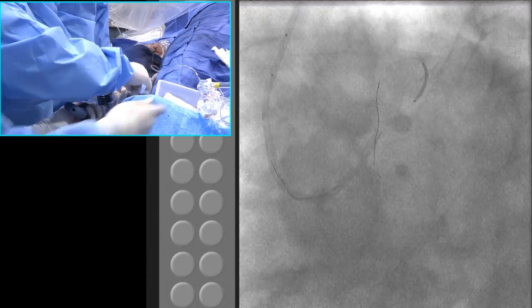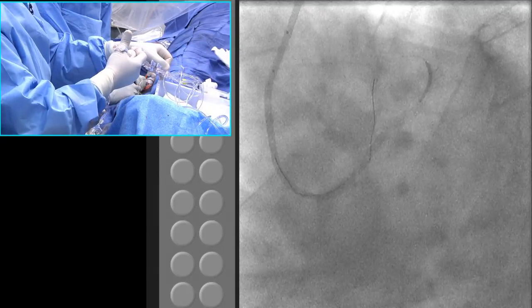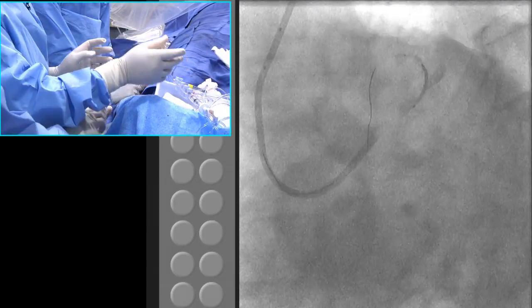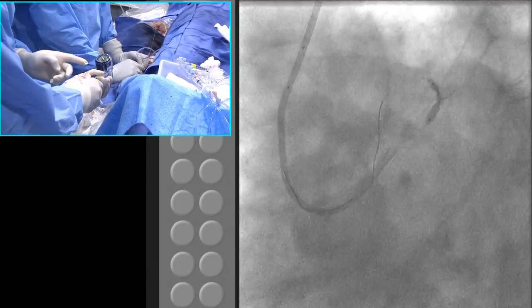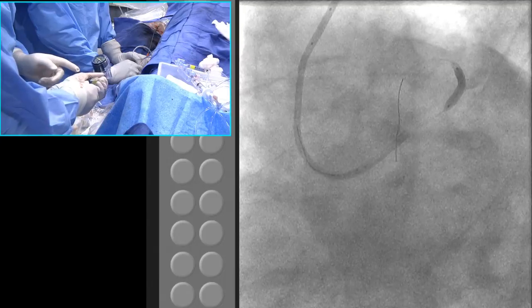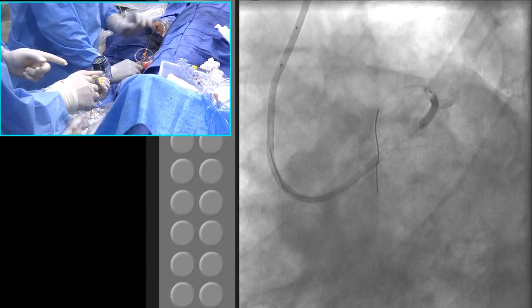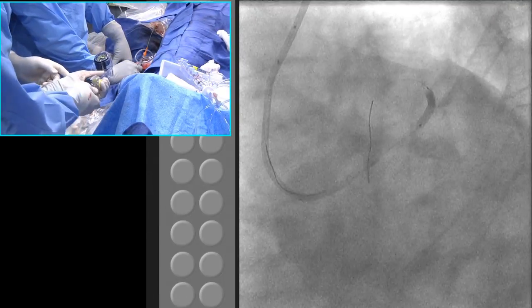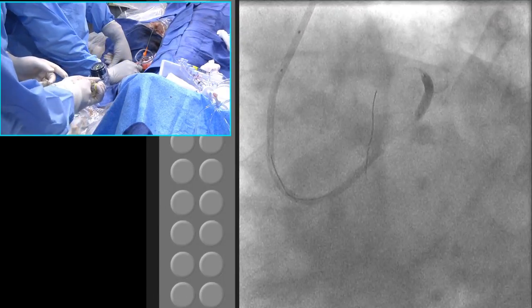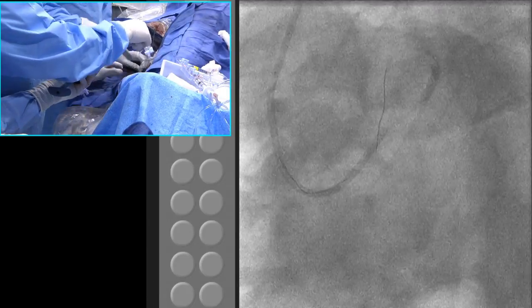Some die. So, Sameer, in the hundreds of such cases you've done, ever had a problem going back with the wire? Yeah, no, the wire usually we can. Which one? Diagonal, more dissection. Distally. How high did you go there with the LAD? 12. Okay. Leave that wire and you take this balloon out.